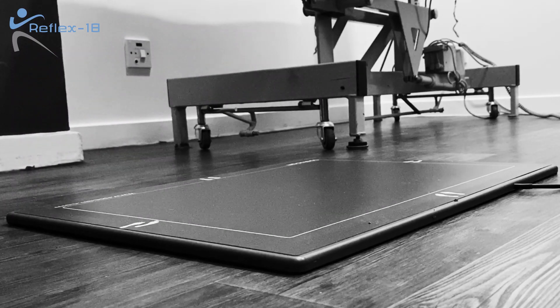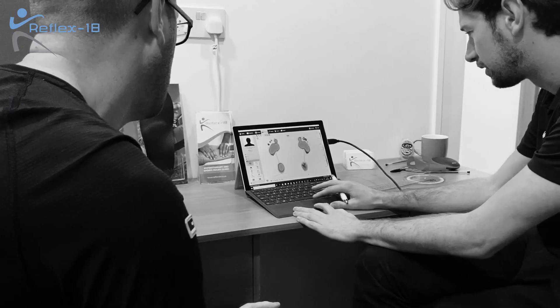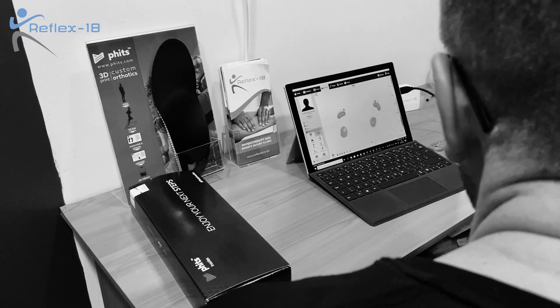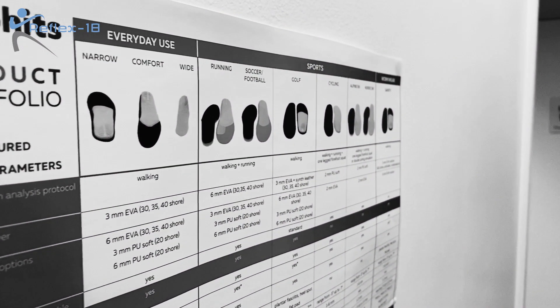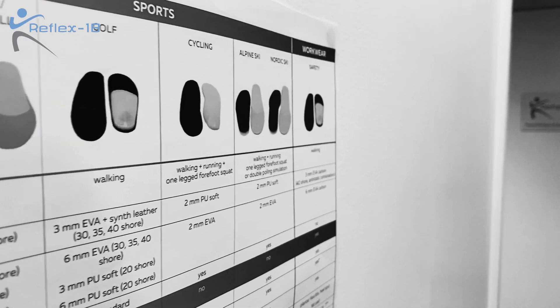Once you've got this data, we'll talk you through all the points of the data right there and then, and tell you about how this may or may not be affecting you. We can then sit down and design the fitted insole, which will be custom made for you for the shoe that you want to wear it in. This can be a football boot, a regular shoe, a running shoe, a ski boot, a golf shoe, or even workwear.